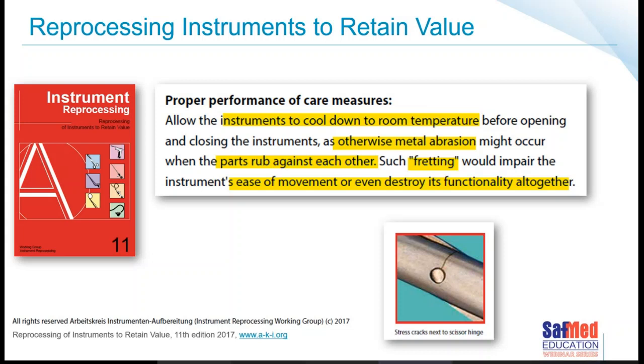Absolutely. The question is, as for pre-enzymatic agent, what is the impact if it leaves foam in the instrument washer during the washing process? Okay, again, depending on the setup of your washer disinfector, it might be necessary for you to pre-rinse. So spraying the instruments with enzymatic pre-treatments keeps them moist during the transport phase, starts to loosen the dirt a little bit, makes it a little bit easier. If you find that you're getting a bit of extra foam formation in your washer disinfector, then you can just pre-rinse them quickly before popping them into the washer disinfector. Everything depends on the setup and formulations, how they all work together.